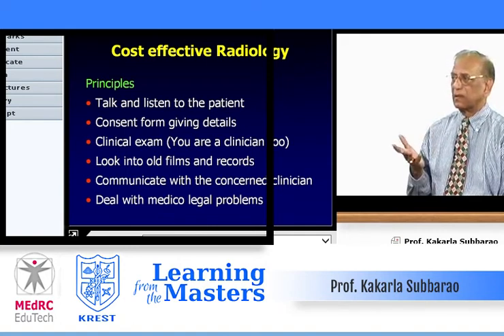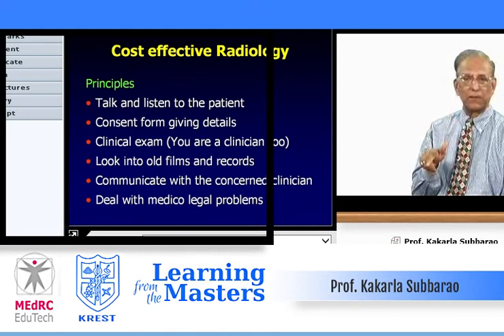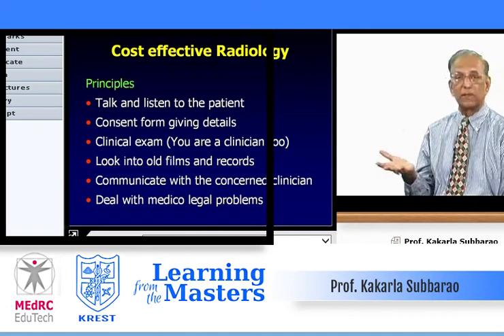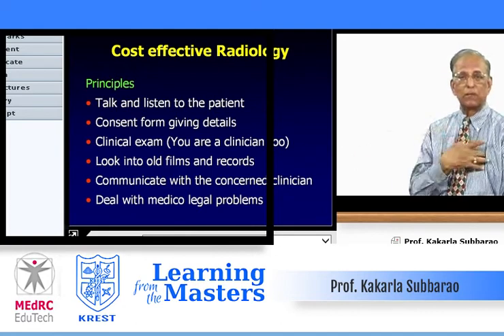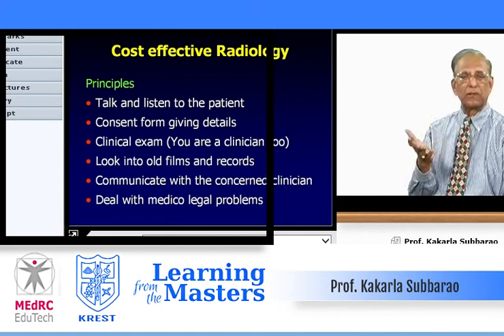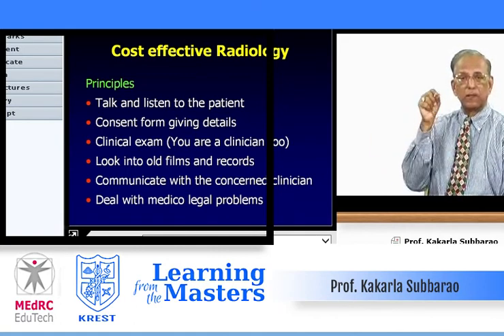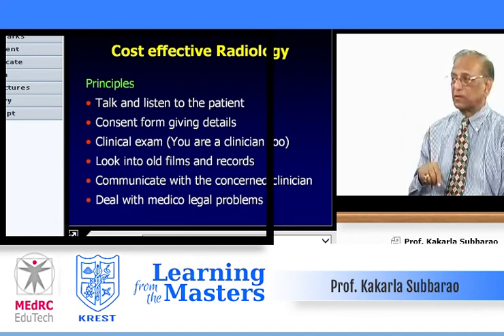As I said earlier, communicate with the clinician too, not only with the patient. The clinician has examined thoroughly and has laboratory findings at hand. This sputum is positive for aspergillus. So immediately you can correlate all the patchy findings in the chest radiograph with aspergillus. So always communicate before writing a one-page differential diagnosis or committing to a definitive diagnosis.